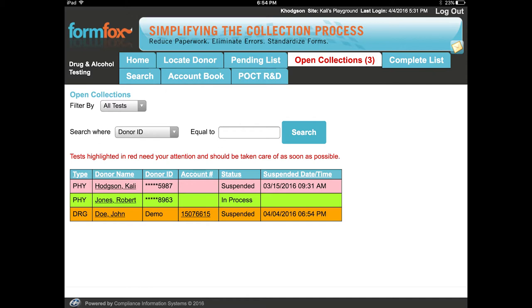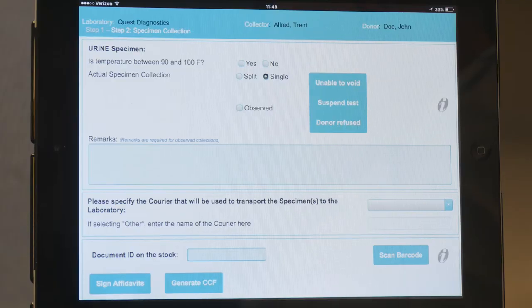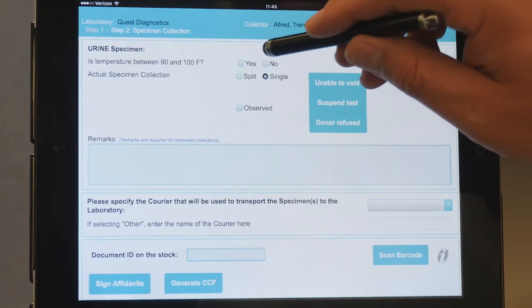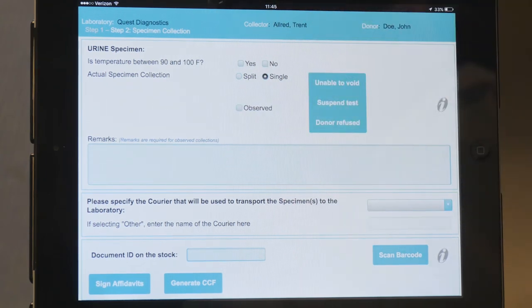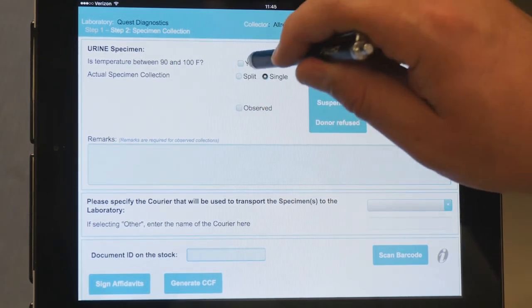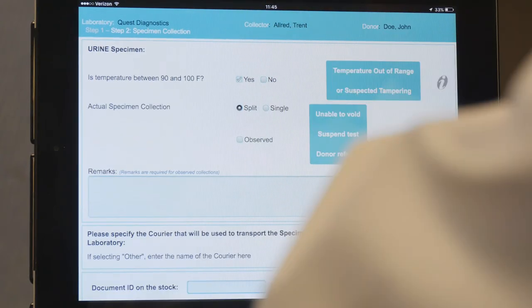If the donor was able to provide a sufficient sample on the first attempt, or after suspending the test the donor is able to provide a sample after drinking some water, and if the sample temperature is within the acceptable range, click the Yes box. If the donor provides a sample outside the acceptable temperature range, tap the No box. You must select one or the other. Once you tap Yes or No, a button appears to the right which says Temperature, Out of Range, or Suspected Tampering.